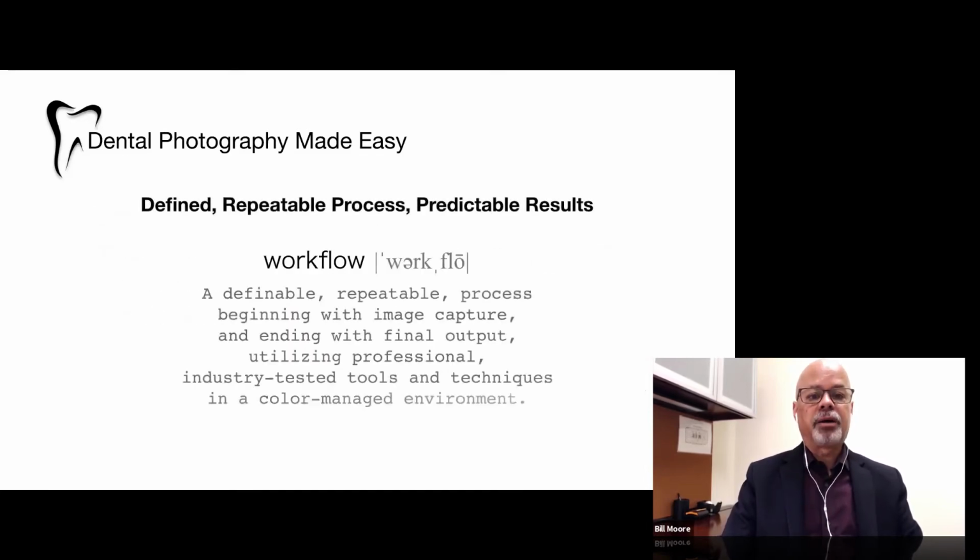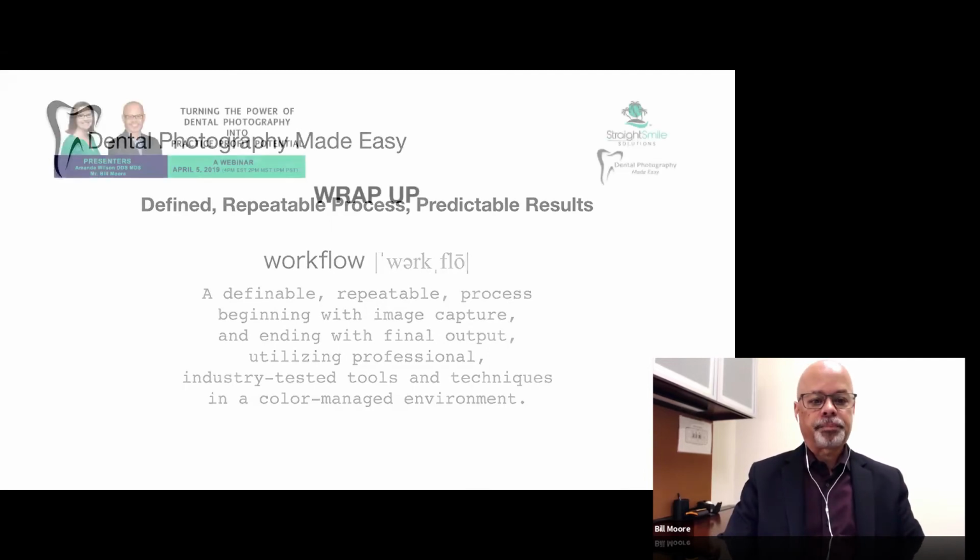Then you need a defined, repeatable process. So whether you're the only one making the dental images, or you and someone on your staff or members of your staff, I know some doctors who have 4 or 5 people that are making the images at the beginning of an exam. Everyone's doing everything the same way every single time. So everything comes out the same all the time. That's really, really important. And that's what I teach.